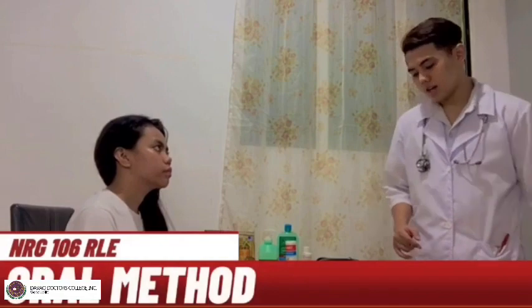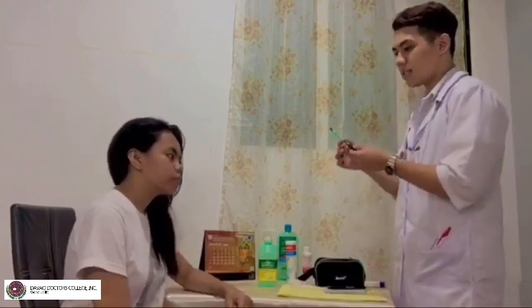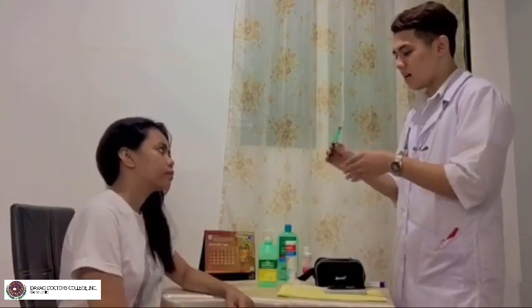Right now, we are going to assess the body temperature of the patient using the oral method. Okay, ma'am. So, karon, kuhaon na ko imuhang temperature orally, okay? This is just an imaginary oral thermometer, okay?